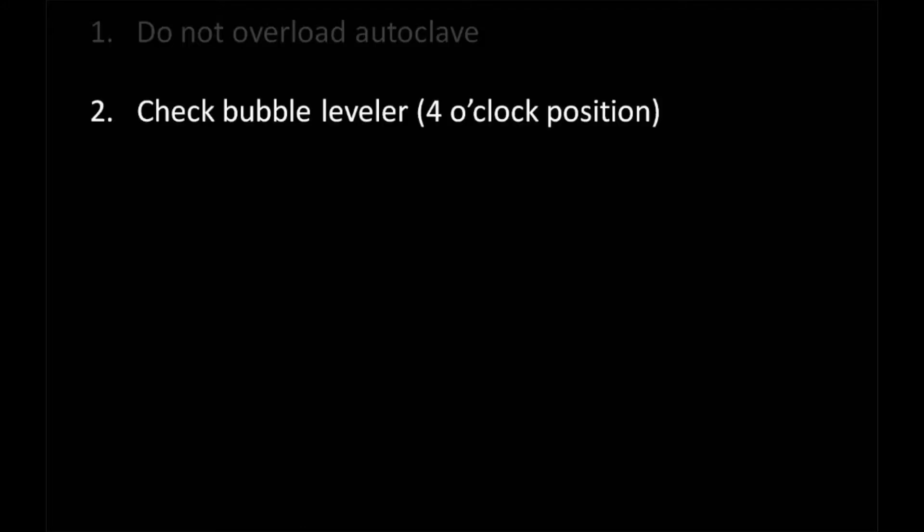Second, check the bubble leveler located on the front of the display. The bubble should be located in the 12 o'clock position.